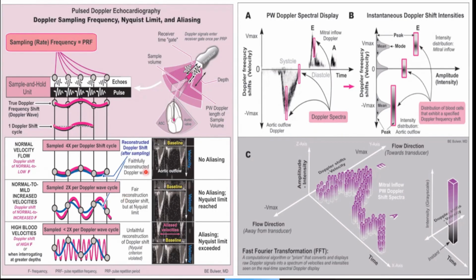So here you are seeing that normal velocity flow, you are using pulse wave Doppler, and there is a faithful reconstruction of the Doppler wave.